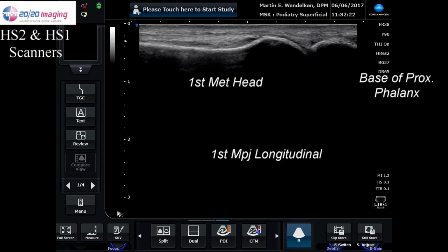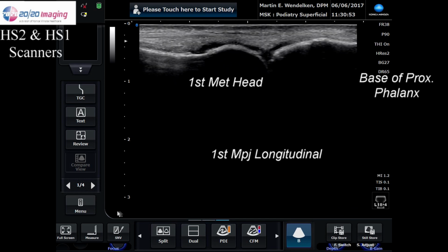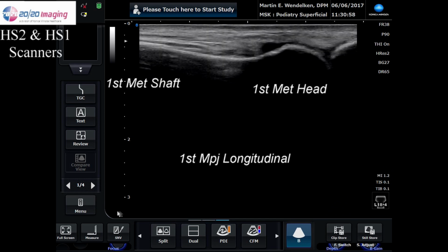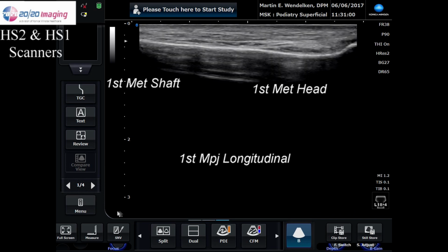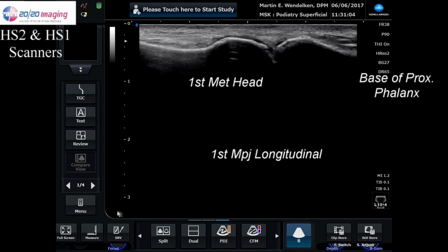Some of the things you might look for here is to look for range of motion. You could look at a hallux limitus. You can see exostoses coming from the joint. You could look for a joint effusion. If you run the probe along the shaft, you can evaluate for a stress fracture, which shows up immediately. You don't have to wait 2 weeks like on an x-ray.